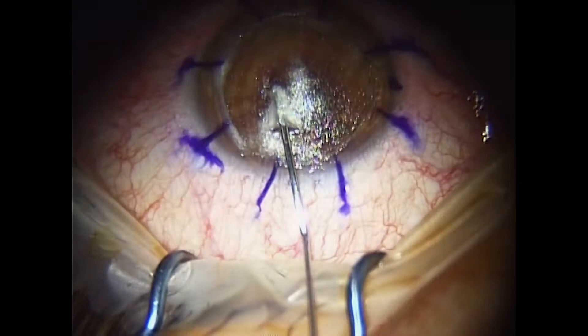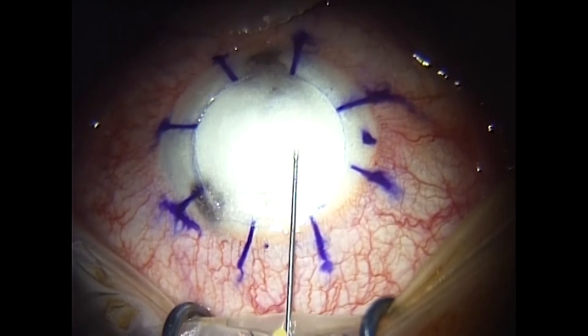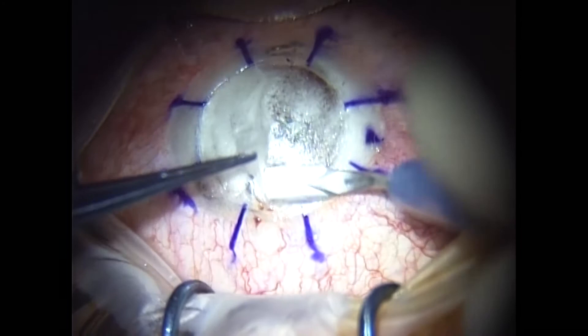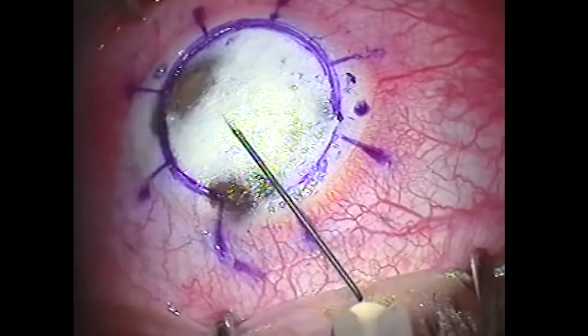This case shows that after the air injection the bubble is not visible. After the delamination and transilluminating the cornea we can corroborate the presence of a medium bubble. But after a new keratectomy and without transilluminating to make sure the bubble is still there, we cut into the anterior chamber. This could have been prevented with a simple check with the light probe. This technique is also fundamental to identify the exact location of small bubbles to help expand them to a correct size, because without identifying them you would have to continue with the manual delamination.